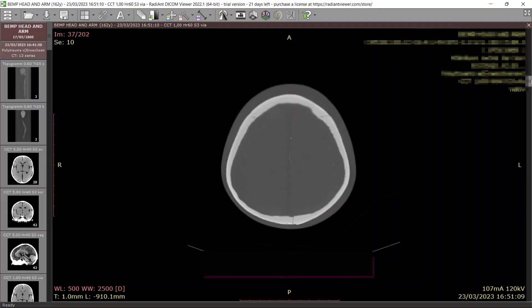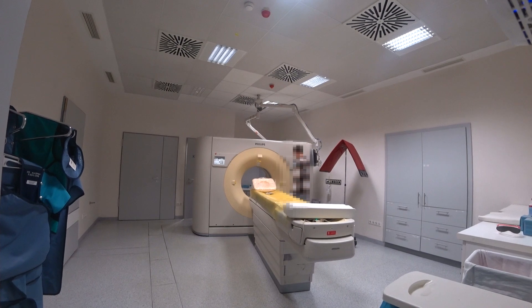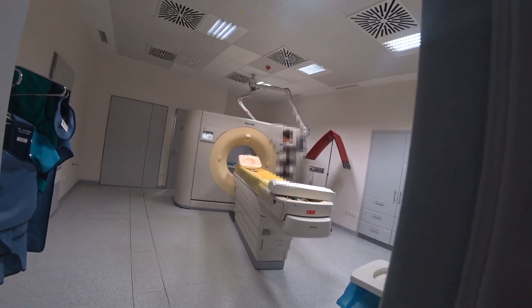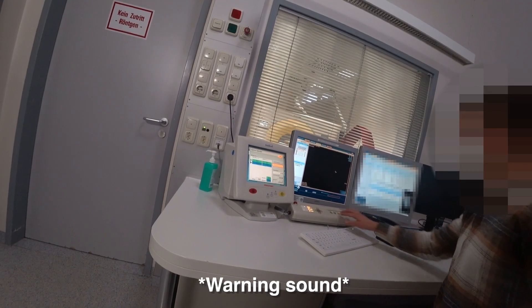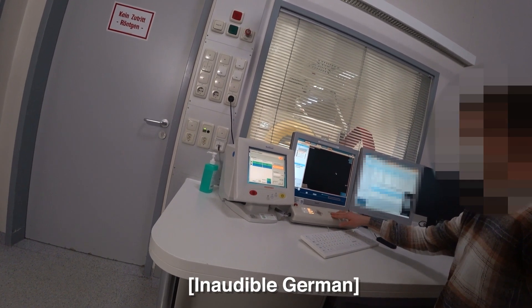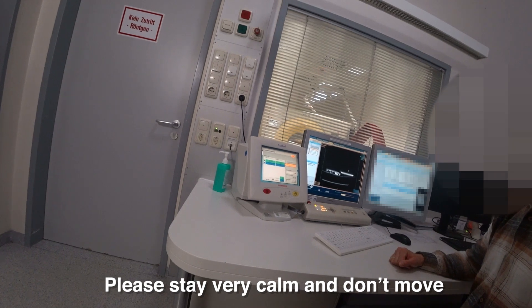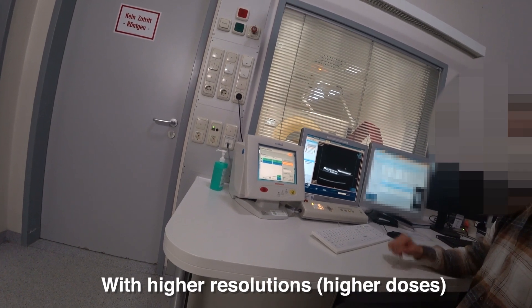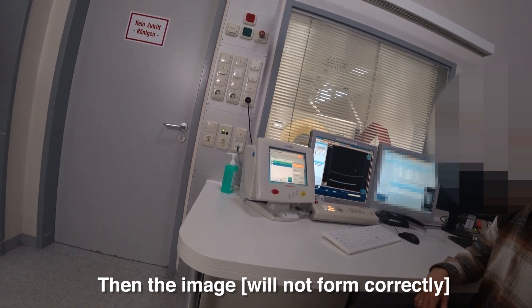Image quality on the CT scanner depends on many things, one being the dose given — the higher the dose, the better the image. Since the Nintendo is not a human, we decided to give a higher than normal dose for a better image. We're doing a whole CT just for the Nintendo. With these high resolution scans, obviously if you move even a little bit, it's already a problem.